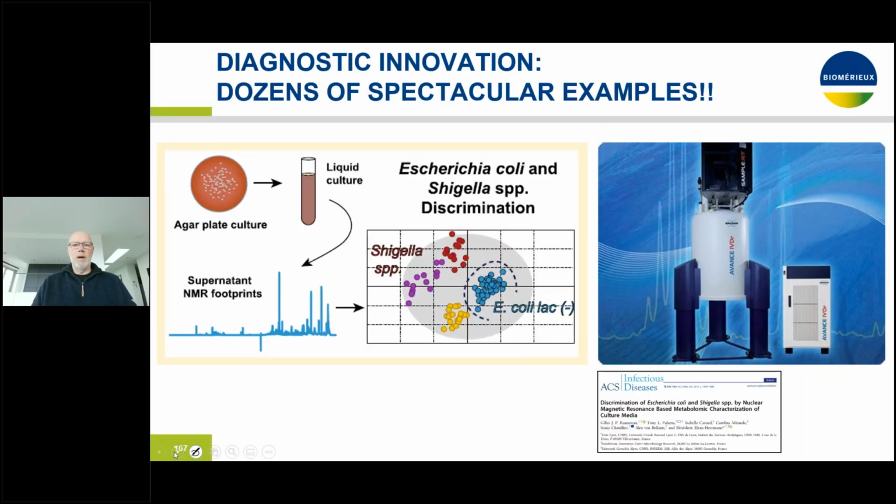Another thing I want to highlight, and which has not been addressed by the previous speakers, is that mass spectrometry is not the holy grail. It is fantastic, don't misunderstand me, it's a fantastic method for bacterial identification and further characterization, but there are things that are not yet realized.